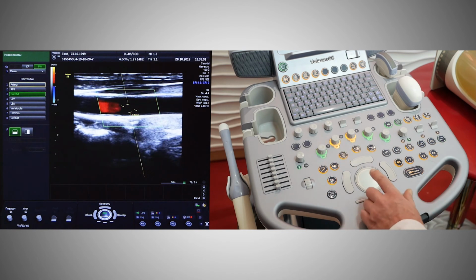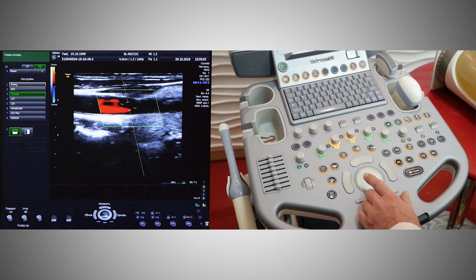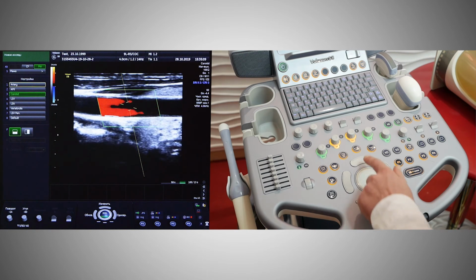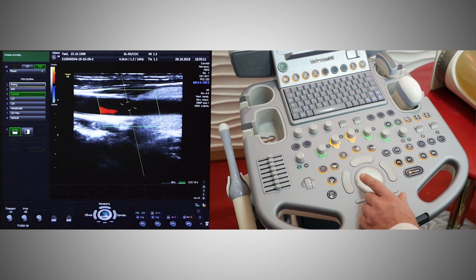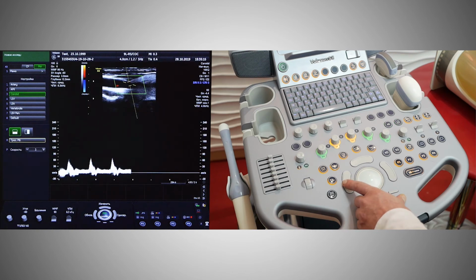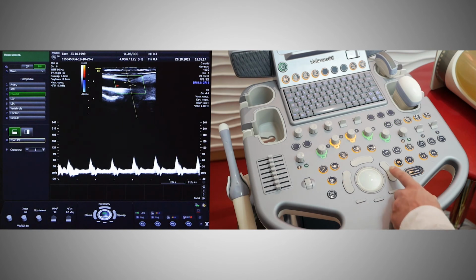Pulse wave Doppler. In this case, we can change the control volume, bigger or smaller, and position, and turn it on or just go for pulse wave Doppler or triplex mode.